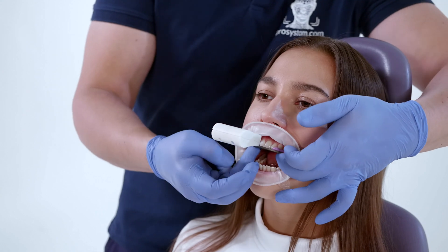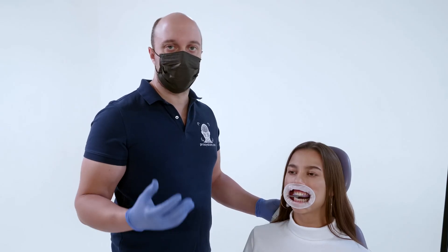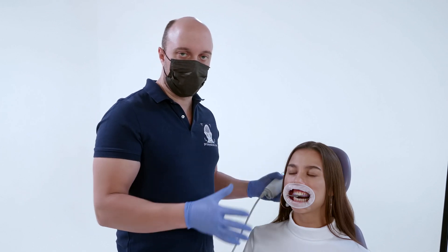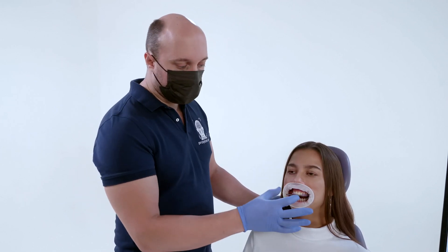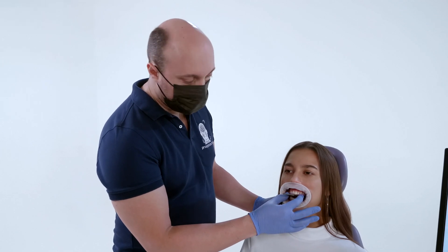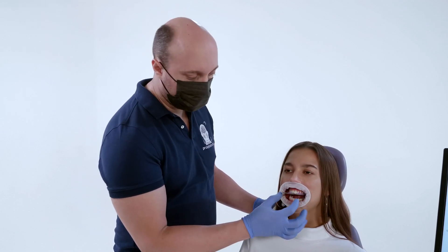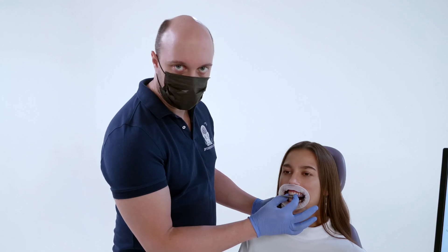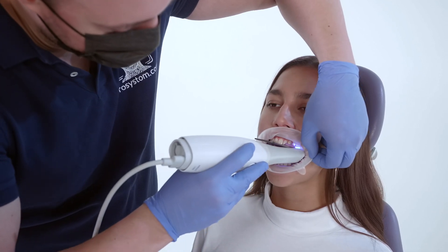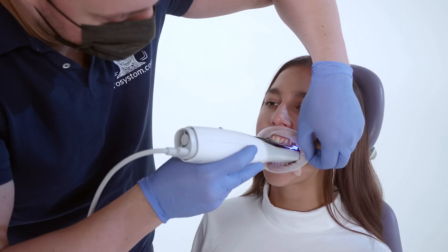It is necessary to obtain an image of the vestibular surface of the dentition, part of the registration material, and the bite fork. It is necessary to scan the distal fork borders from the side and the occlusal surfaces. It is also necessary to scan the part of the bite fork which is located in front of the frontal group of teeth.